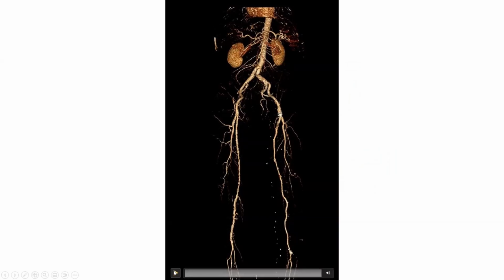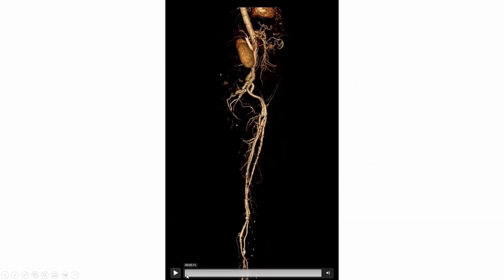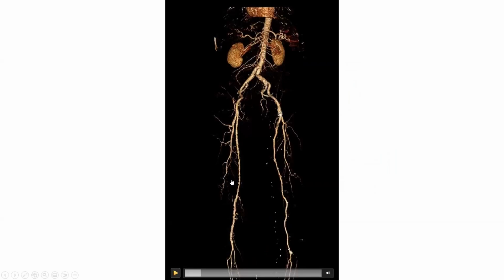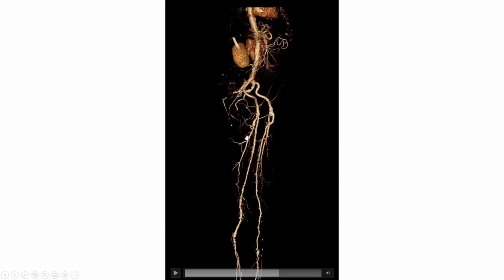And this is an illustration from a CT scan that shows you what I'm talking about. So here you see on AP imaging how they look. And then if we go laterally, look how this is the common femoral. And this is how it takes a very deep, sharp dive above the inguinal ligament into that loose, non-constraining pelvis, where you can bleed many liters of blood before the bleeding stops. Also, you can see how the profunda takes a sharp posterior takeoff dive into the thigh.